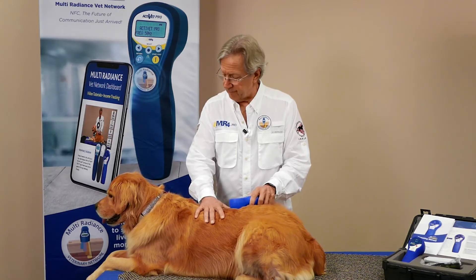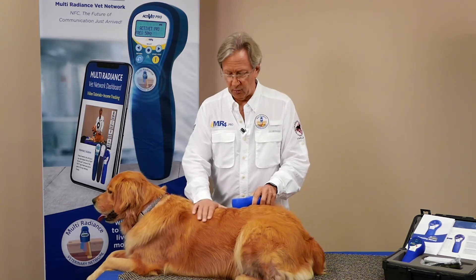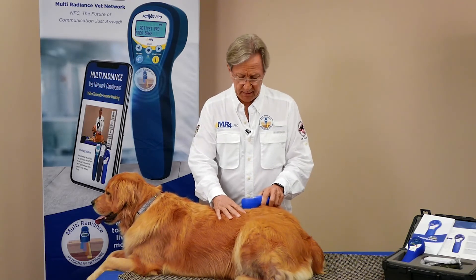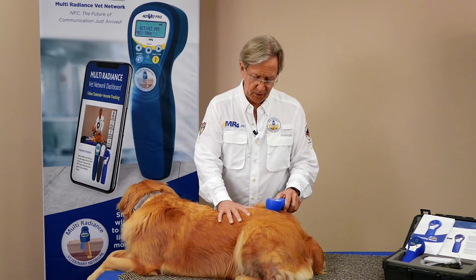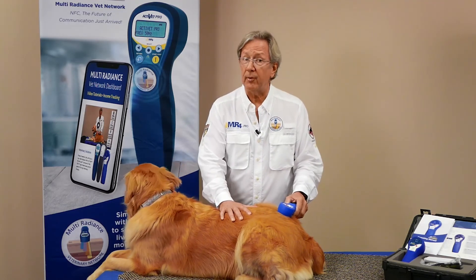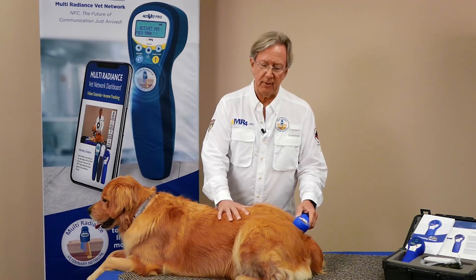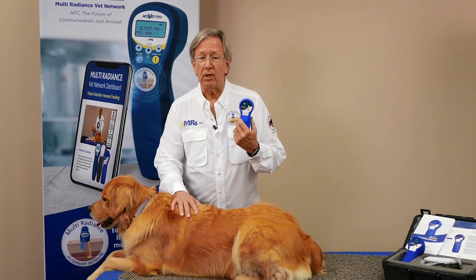The convenience is great for the client, but look at Tango — not a care in the world, very happy. There's typically an endorphin response that makes them feel really nice, chill, and calm. It's just that simple to do the unwind protocol for pain — a simple automatic five-minute timer, no more complicated than that.